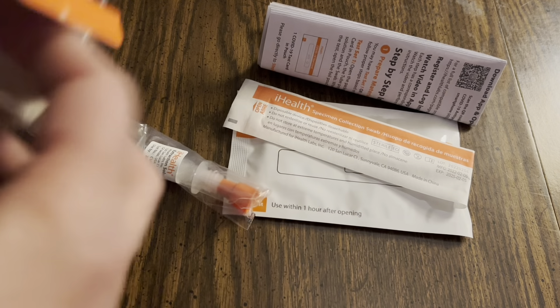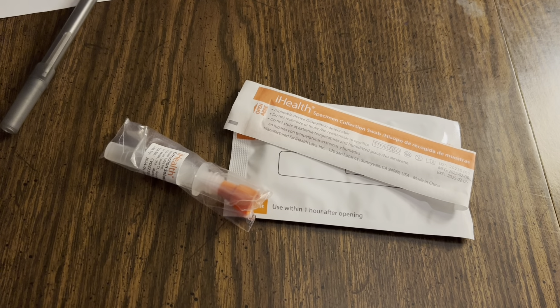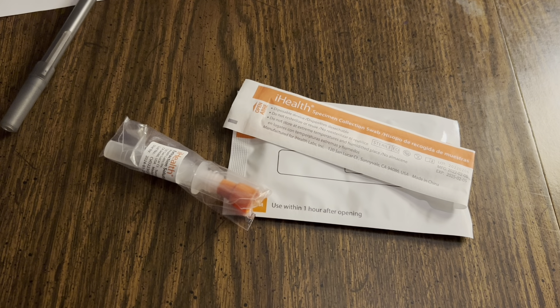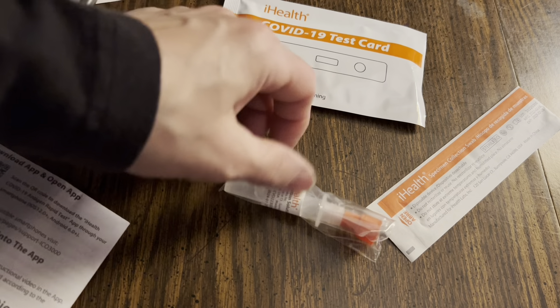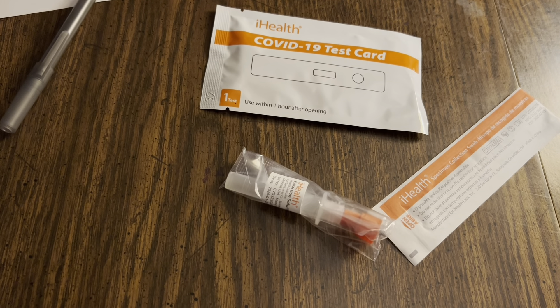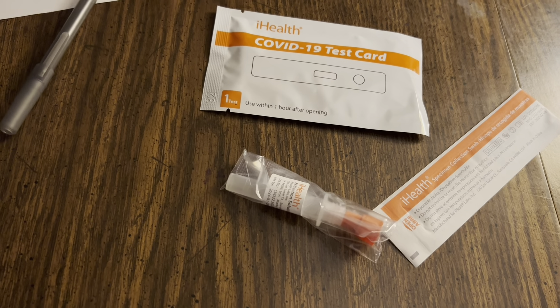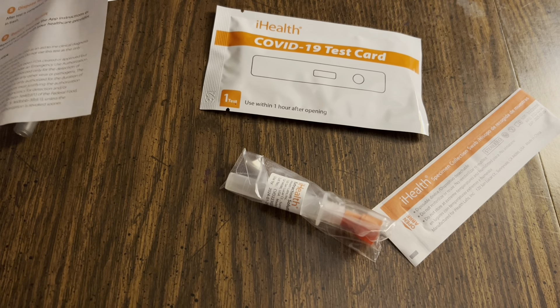Let me take one of these. So it's open. I'll show you how to do this step by step. Step by step instructions: preparing materials — get the swab, get the test card, and get the liquid. Getting all ready.